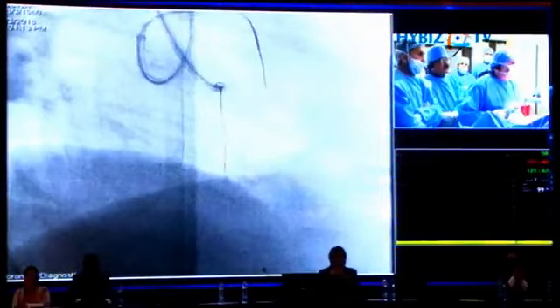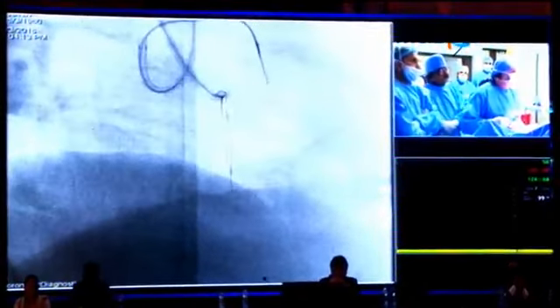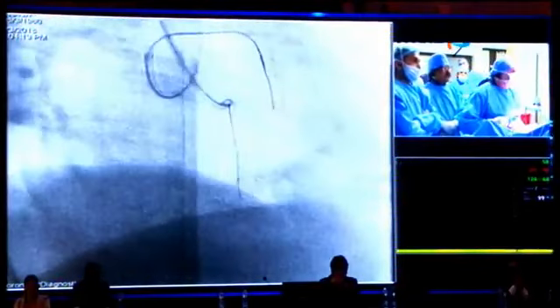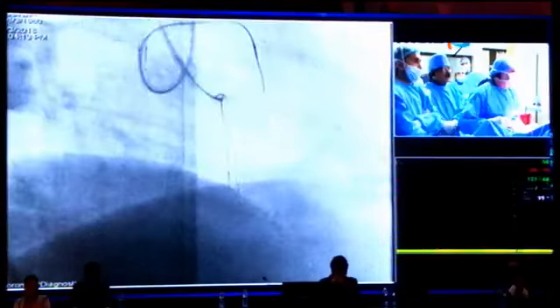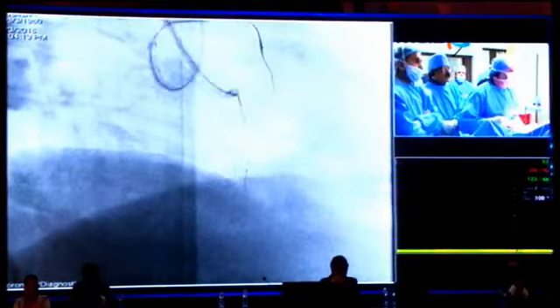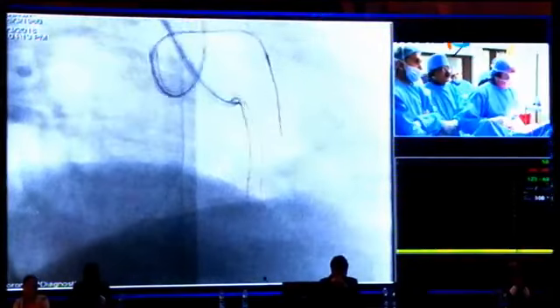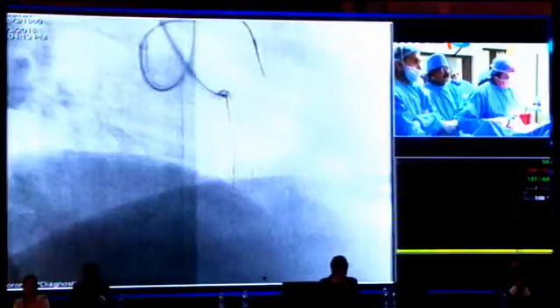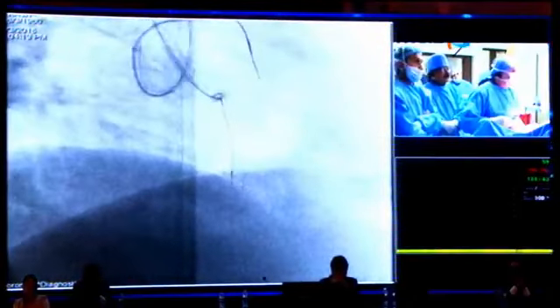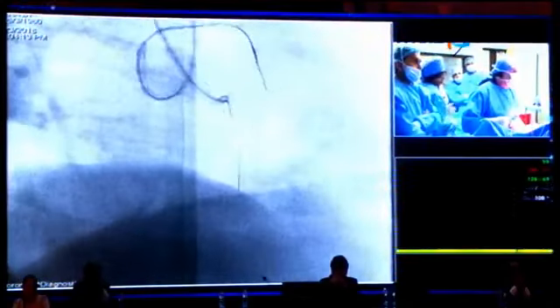Because we need to move into the anterior part, the front one. Maybe a little wire back. You need to move it from the front. See, Dr. Goyal, what we have learned from this IJCTO is that in the retrograde techniques, most of the time we are taking upfront the SO3 wires rather than trying these wires. What do you feel? Incidentally, I don't have the SO3 here right now.